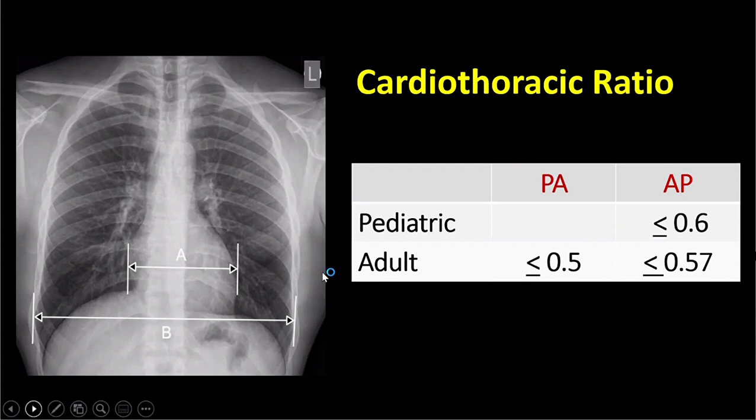But for most, when we do chest X-ray, we do just using the front, the PA view. We are already able to assess if there's a certain degree of cardiomegaly or heart enlargement or not. In the pediatric group, usually less than 6 years old, we do not do PA view. Usually in the pediatric group, the standard examinations or requests that you do would be AP.